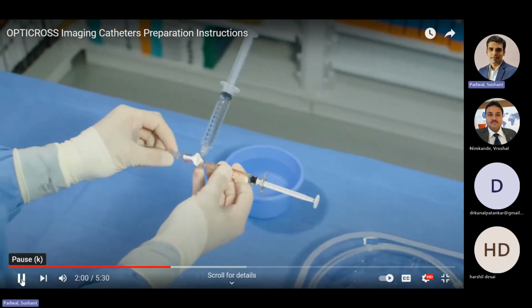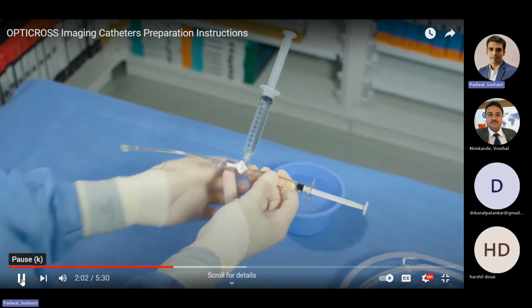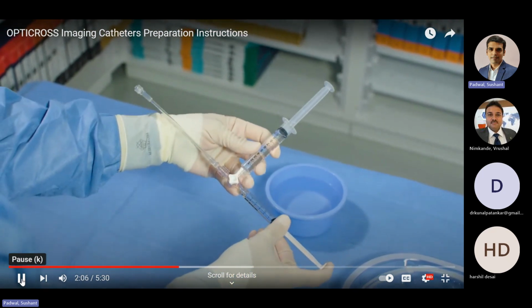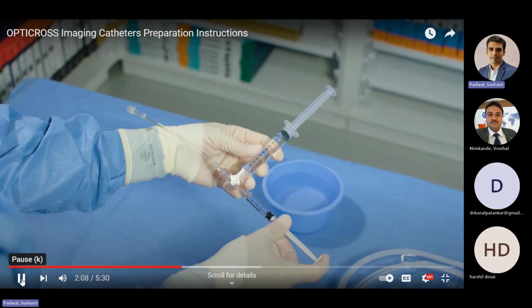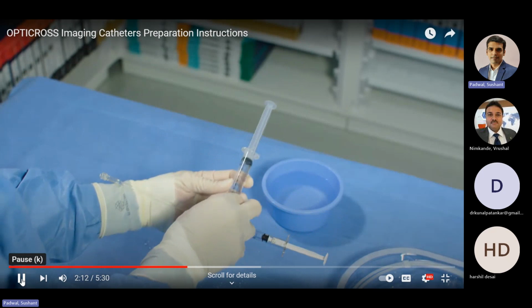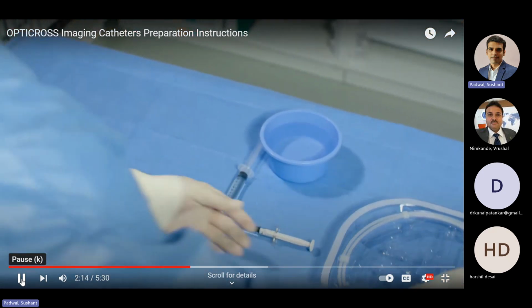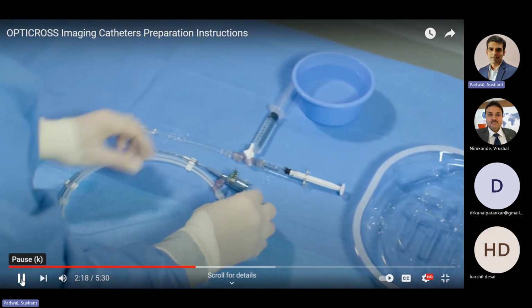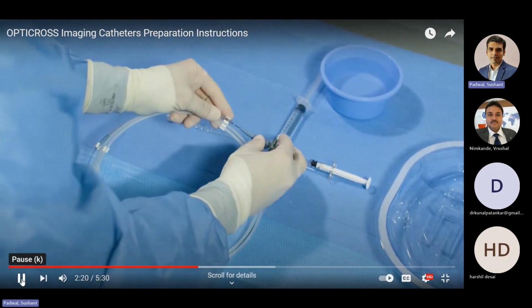Connect the extension tubing to the 9 o'clock position of the stopcock and expel all air by flushing with the 3 cc syringe. Fully open the telescope on the imaging catheter by pulling the telescope from the hub of the catheter and attach the extension.